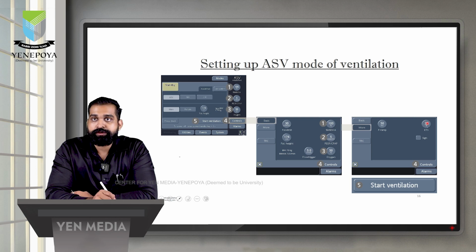But this needs to be looked at. It has to be set based on the respiratory morphology, inspiratory time, the total cycle time, etc.